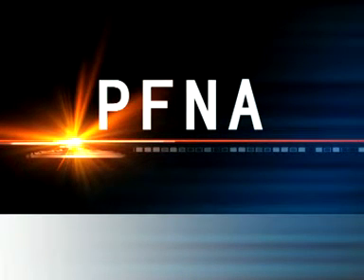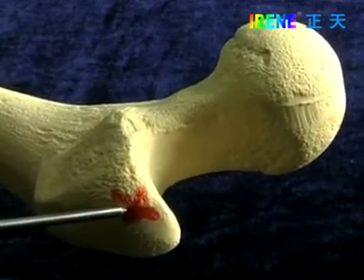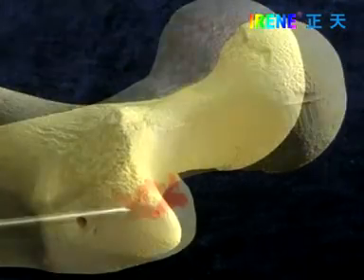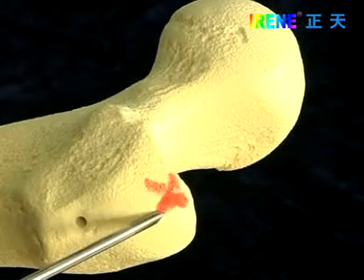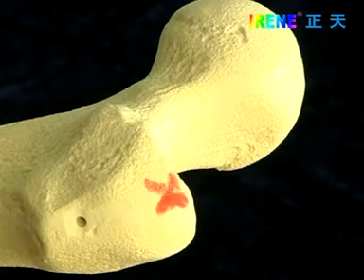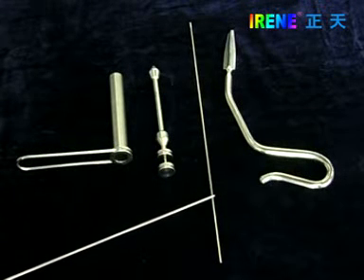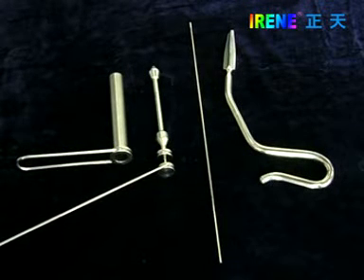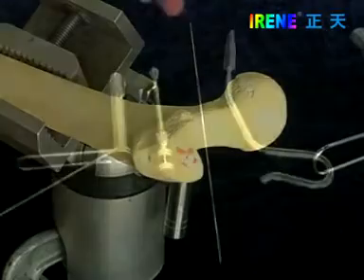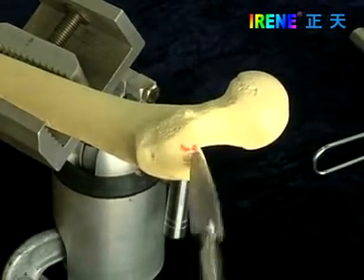Surgical guide of PFNA. Make a 5 centimeter incision approximately 5 to 10 centimeters proximal from the tip of the greater trochanter. Make a parallel incision of the fasciae of the gluteus medius and split the gluteus medius in line with the fibers. The instruments include the awl, threaded guide pin, drill sleeve and pin, and protection sleeve. Use the awl for the opening of the proximal cortex.